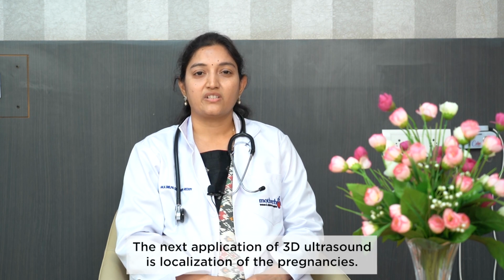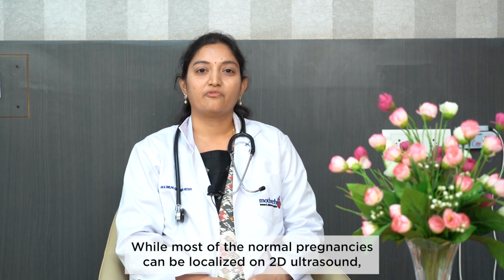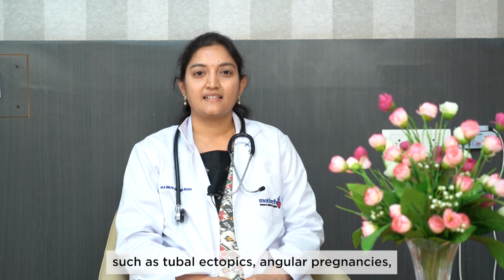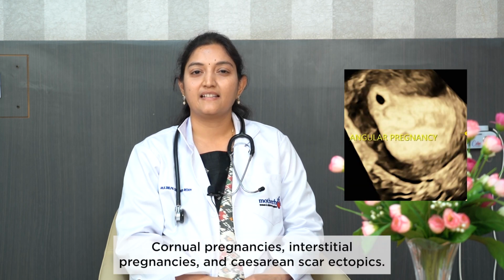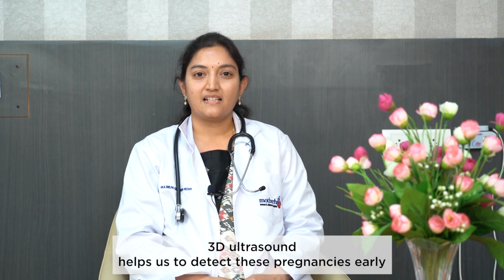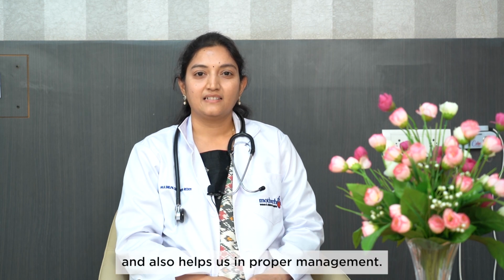The next application of 3D ultrasound is localization of pregnancies. While most normal pregnancies can be localized on 2D ultrasound, some complicated pregnancies pose a diagnostic challenge, such as tubal ectopics, angular pregnancies, cornual pregnancies, interstitial pregnancies, and caesarean scar ectopics. 3D ultrasound helps us to detect these pregnancies early and also helps us in proper management.